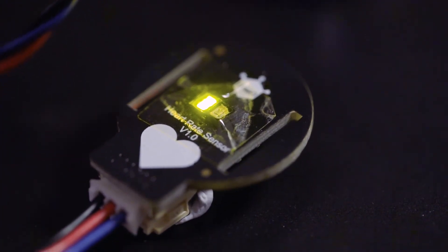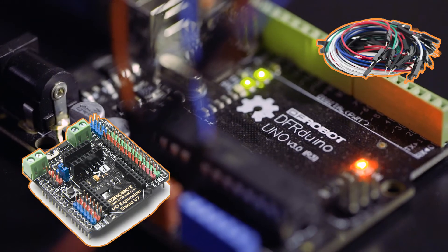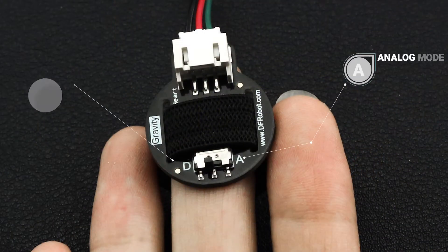Now it's time to get our heart rate monitor up and running. Connect to an Arduino board with an expansion shield or jumper wires. The optical heart rate sensor supports both analog and digital output.